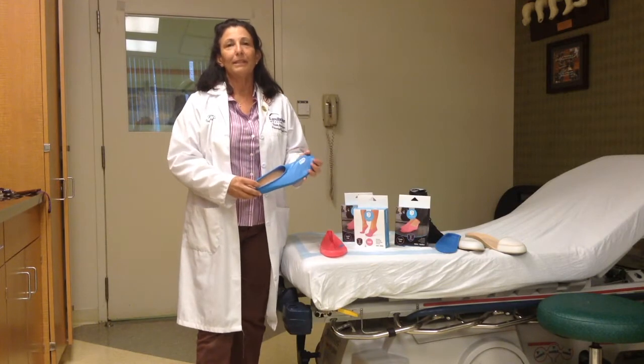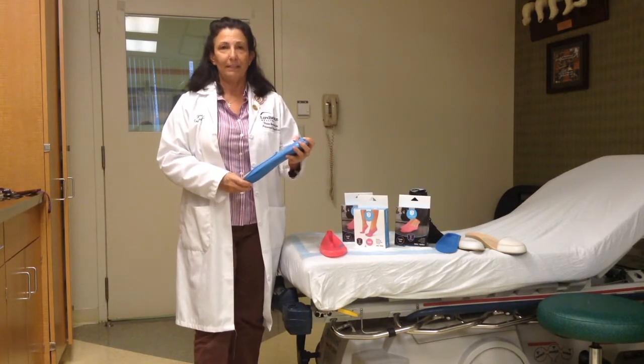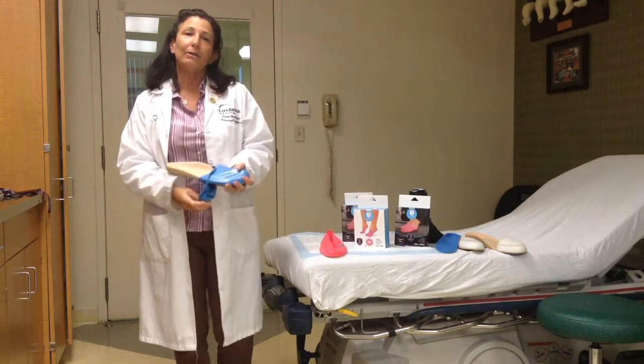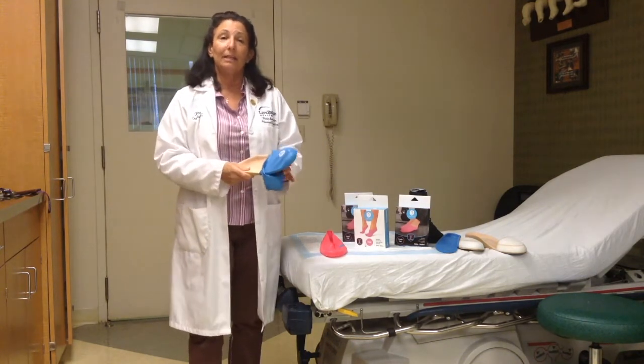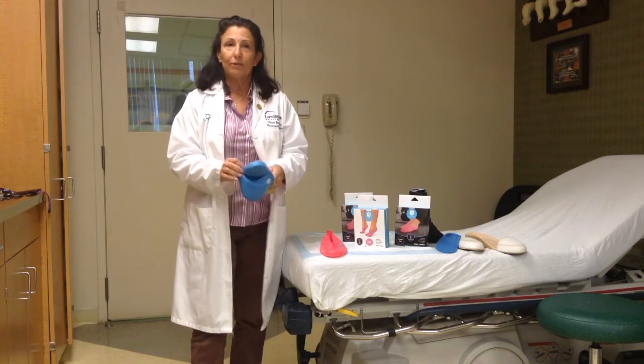Hi, I'm Teresa Albert, Orthotist and Certified Pedorthist, here to talk to you about Jellyfeet. Today I want to talk about how I can use the Jellyfeet foot covering as an overlay on a toe filler for an amputation.